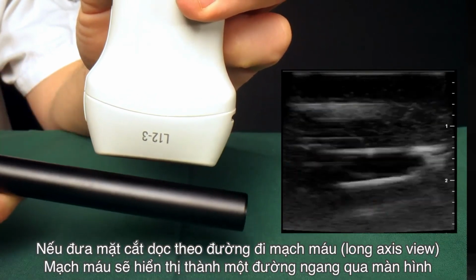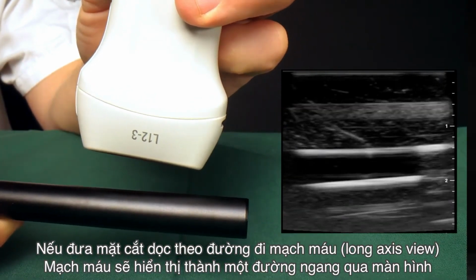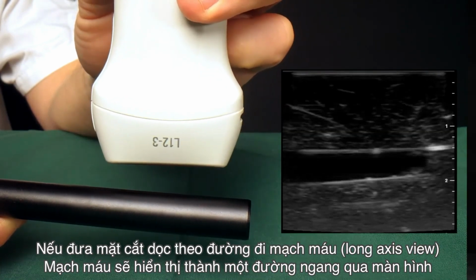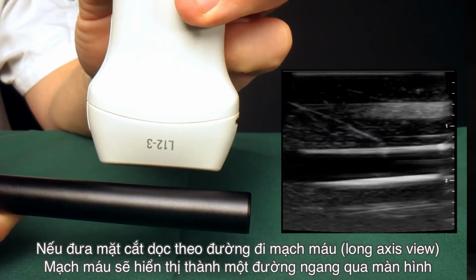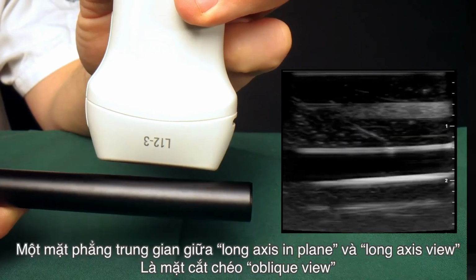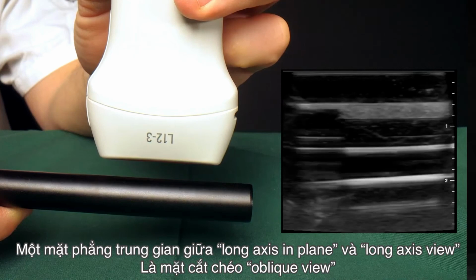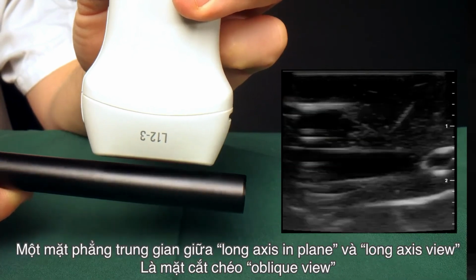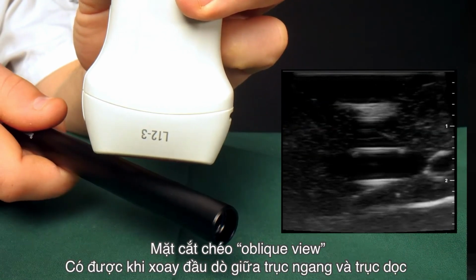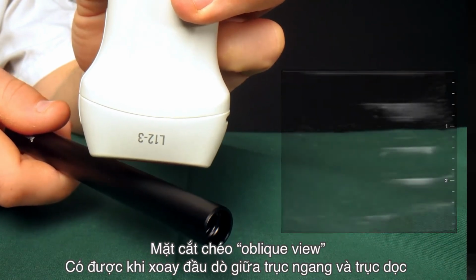If we place the plane along the vessel, it's called the long axis view, and you see the length of the tube. The vessel appears as a horizontal bar. There's also a middle way, the oblique view. It's obtained by going halfway between short and long axis. We'll get back to why you need to master this in just a little bit.